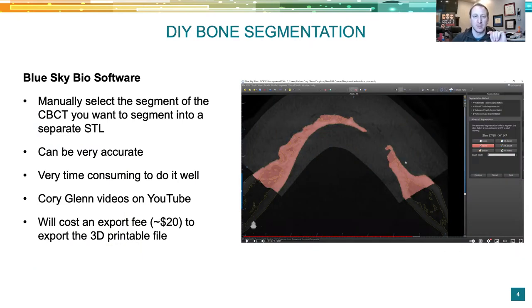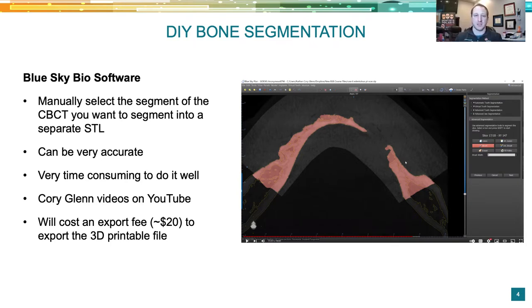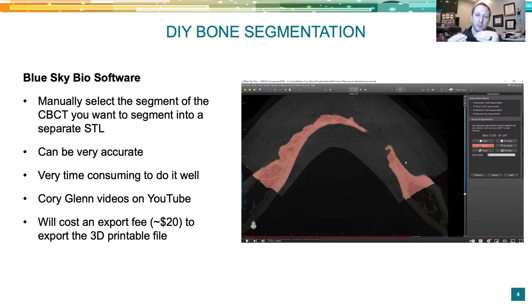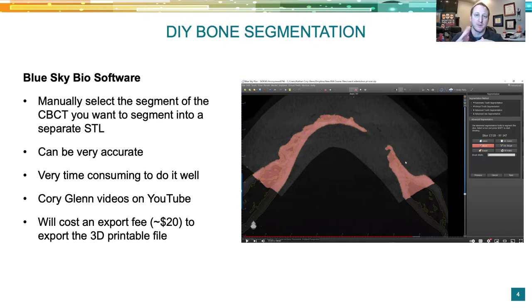One of the first ways I learned was in Blue Sky Bio, a free software where they charge you to export files. You can do all sorts of things inside the software on CBCTs — surgical planning, guided design, dentures, ortho — all free to explore. Once you want to export the file, you pay around a $20 export fee to get a 3D printable file. You can manually do bone segmentation in Blue Sky Bio and it can be very accurate, but it's extremely time consuming and tedious.